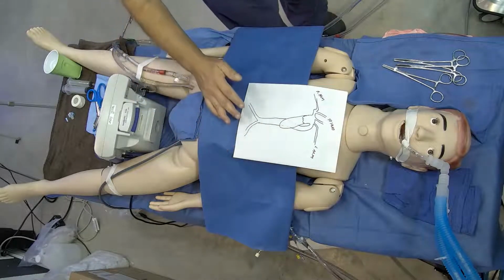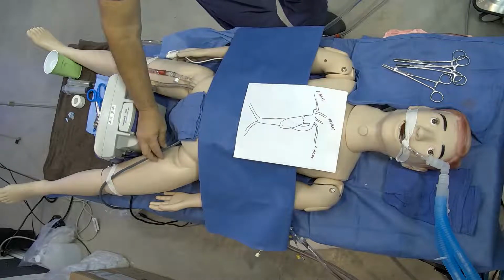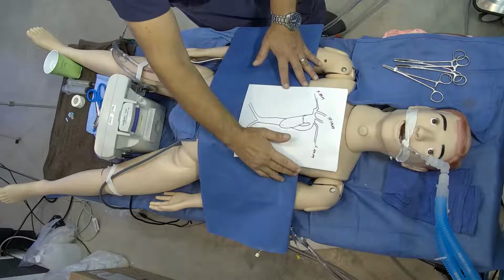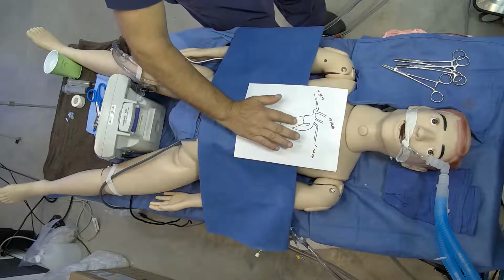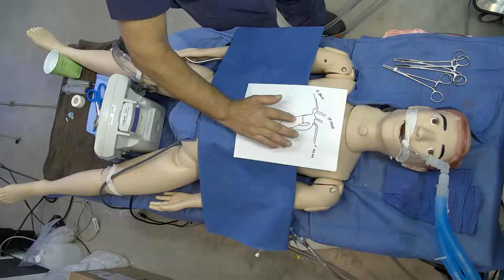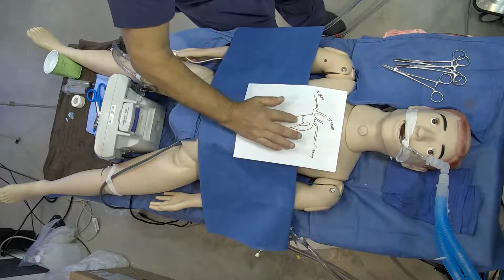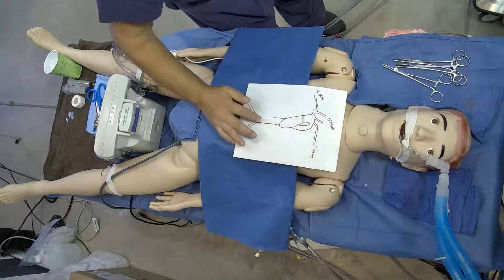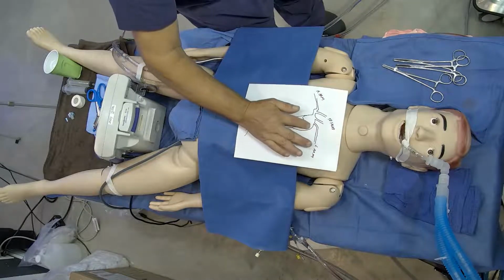But in addition to this, we have this Impella. And the lungs are obliterated, so the LV is filling with desaturated blood. That blood is getting ejected straight out of here, up and around, and interfering with our flow here.